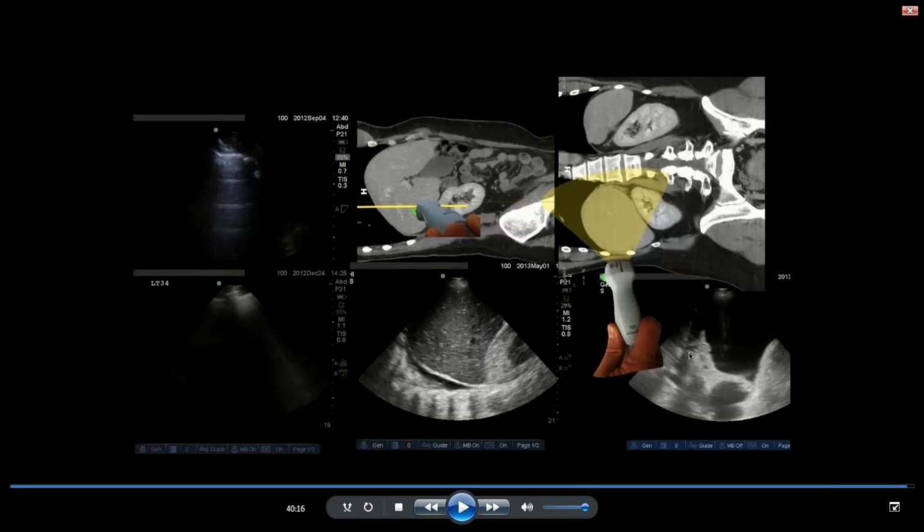So, this is beyond the scope of the seminar, but you can actually measure the pocket size, so you can measure the distance between the visceral and the parietal pleura, and based on the measurements you can guesstimate the size of the pleural effusion. I will though mention that a chest x-ray, for example, would pick up an effusion that's 150 milliliters or bigger. But with ultrasound, you can pick up significantly smaller effusions. And hopefully in subsequent seminars on advanced applications of lung ultrasound, we'll be able to discuss some of those details.